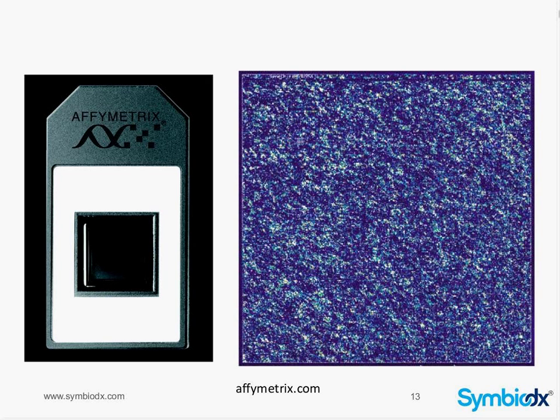This technology is relatively expensive. It's time-consuming to operate, and at the end of the day, you really get one genome. You get one SNP array or one more specific array. You're really just looking at one copy of what it is you're looking at. So people were actually running these in duplicate or triplicate and using it mainly for research. It is in use clinically, most notably in the Veracyte tests that we do for thyroid cancer. So there have been some clinical applications, but it really was not an ideal technology.